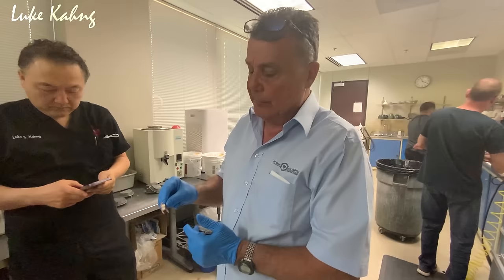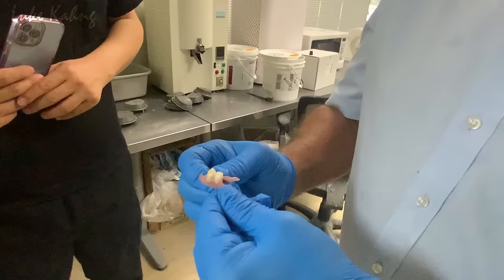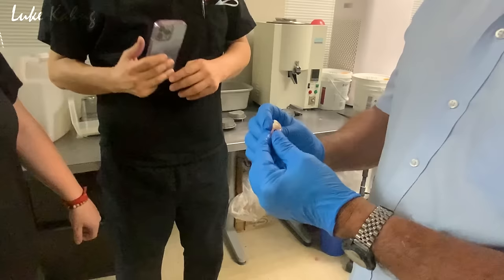Take it out of the water. You kind of bend it in without being afraid of breaking it. It's going to bend in pretty cool. And then at the same time with the pressure, you run it under cold water, which I'll show you now. If you have to do both sides, you do one side at a time. You flip it over and do the same thing, and you bend it in and it'll tighten it up completely. Okay? Show me. So now we'll do it now.